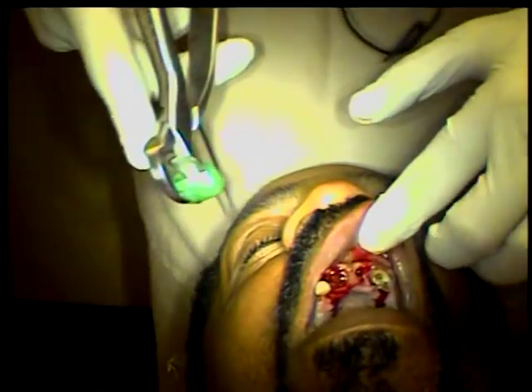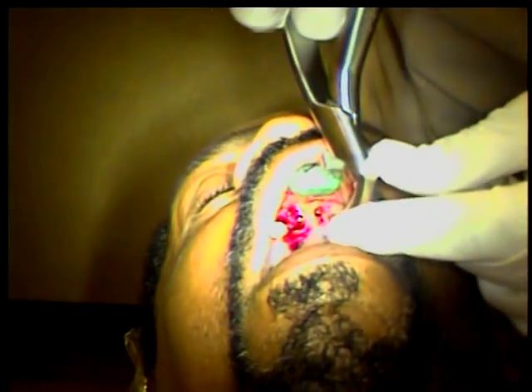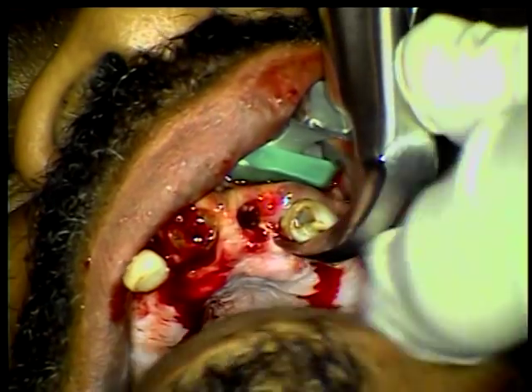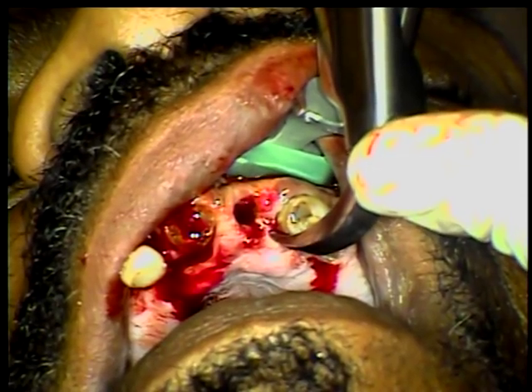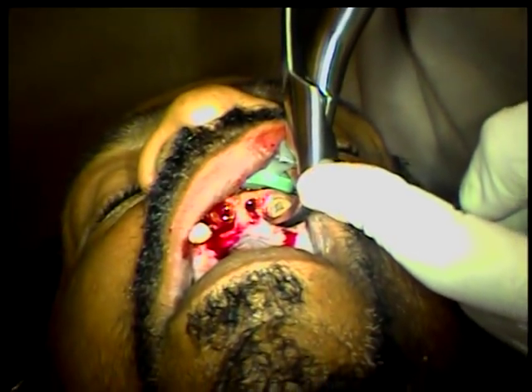Now on the 9, 10, and 11, you stand on the other side of the patient. This one I may not be able to do because there's nothing to hold onto, so we're going to go to ten, come back to nine. Again, I'm going to use two fingers and balance the beak. Two fingers, wrist movement, two fingers — the tooth is out.